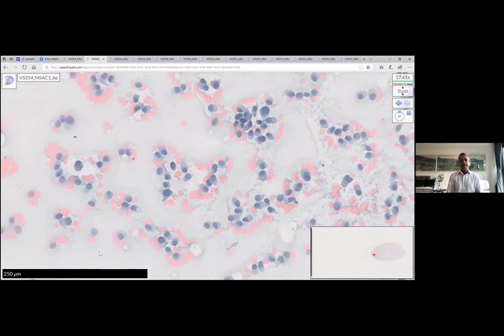Absolutely, Tony. Thank you. Melanoma has caught all of us out at some point, so just don't forget it in your differentials. This is a fairly typical appearance of a melanoma. Lobular breast carcinoma doesn't really look much like this. A plasmacytoid carcinoma does, but that is very rare again. So just do a small panel of markers to start with, or if you feel confident in calling it a melanoma as your top differential, then say that, and say that you would do the immunostains to confirm your diagnosis and to exclude the differentials.